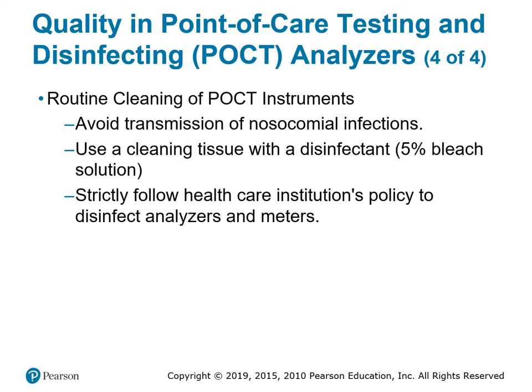All right. Routine cleaning of POCT instruments avoids transmission of nosocomial infections. Use a cleaning tissue with a disinfectant 5% bleach solution. Strictly follow the healthcare institution's policy to disinfect analyzers and meters.